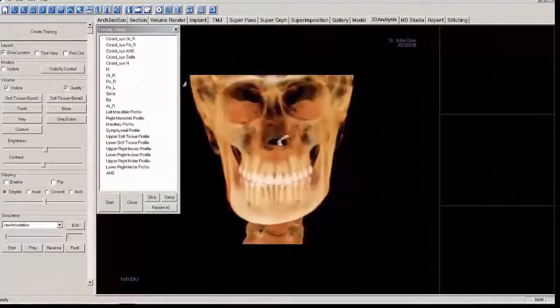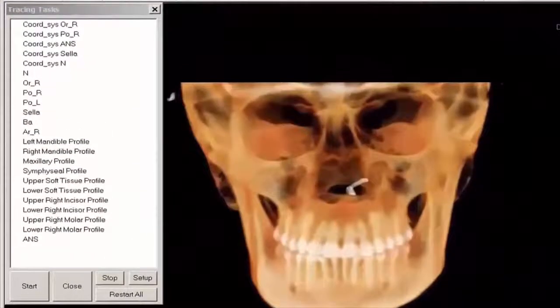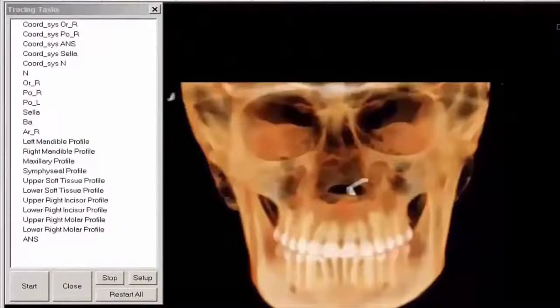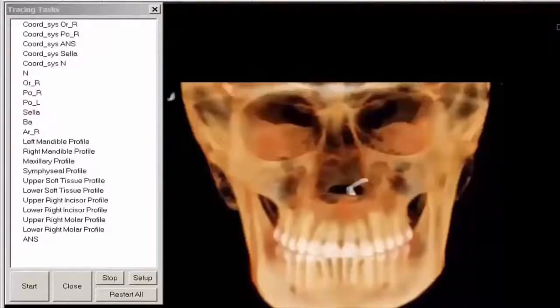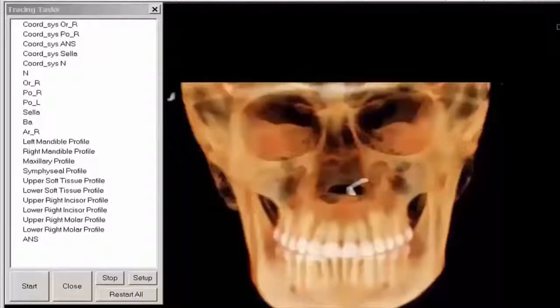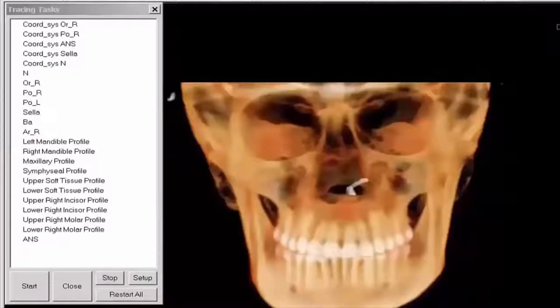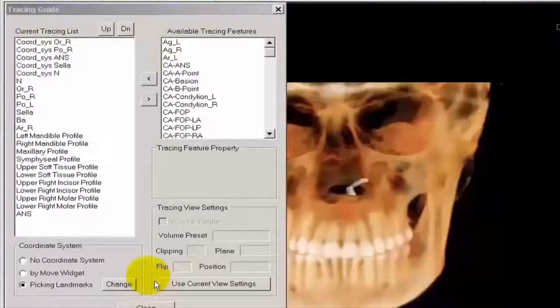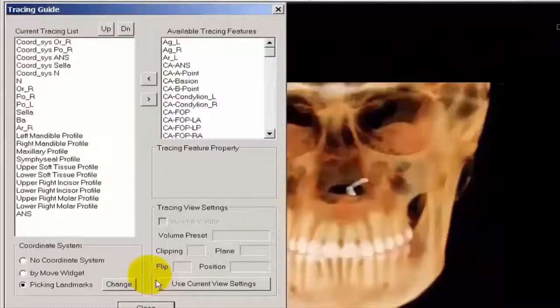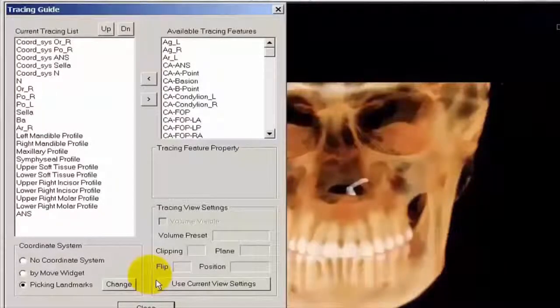Within the Tracing Task window, we have individual landmarks to be marked and profiles to be drawn. These landmarks and profiles may be changed depending upon the requirements of a particular analysis. Treatment Studio's default analysis is Steiner. Let's take a look at how to customize the tracing task. First, click Setup at the bottom right of the window. If you would like to remove any of the tasks shown, simply left-mouse click on it and choose the right arrow — it will move the task to available tracing features.